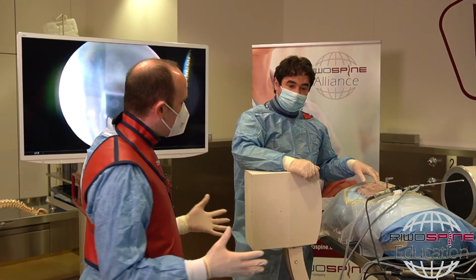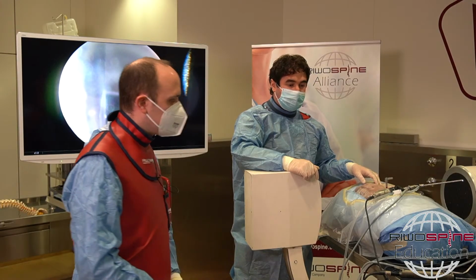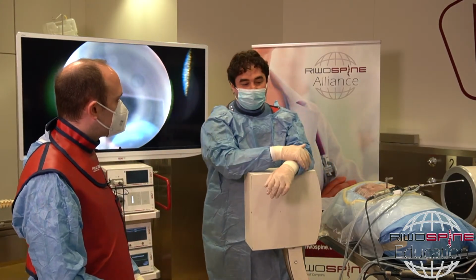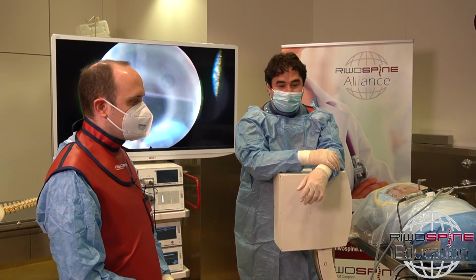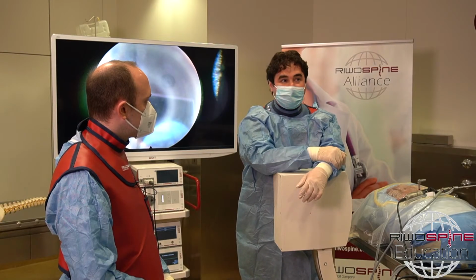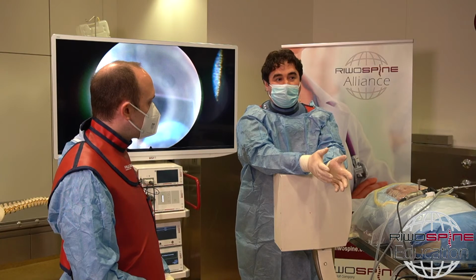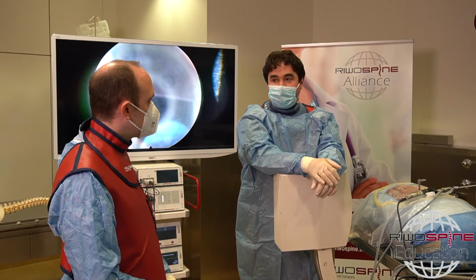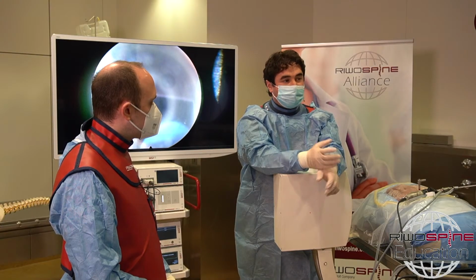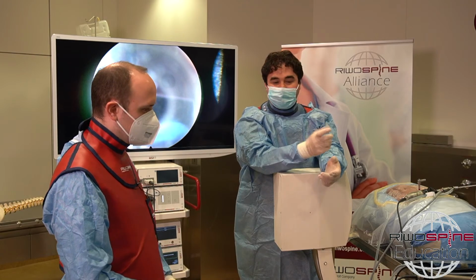Does it matter if the patient is a very heavy patient or a very thin patient? What is the difference? This is the big advantage of full endoscopic surgery. It doesn't matter for us. We just mark the interlaminar window and we introduce the dilator and the sleeve on the bone and on the flavum ligament. This is the big advantage of the full endoscopic approach, that you don't care about the patient's size or the fatty tissues there.